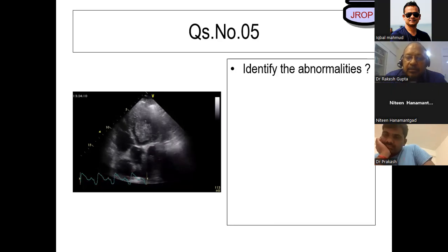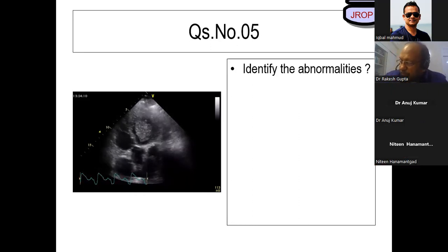Sir, why is the ECG abnormal? It looks like arrhythmogenic RV or something. Arrhythmogenic RV is different. I'll come to arrhythmogenic RV in a couple of minutes. Sir, the ECG looks a bit abnormal there. I was thinking of ST elevation, LBBB. Okay, thank you. Is it possible to remove such a large thrombus? Yes, we do embolectomies. We try to do thrombectomies, because there is a very high potential of migration into the systemic circulation. Yes, sir.